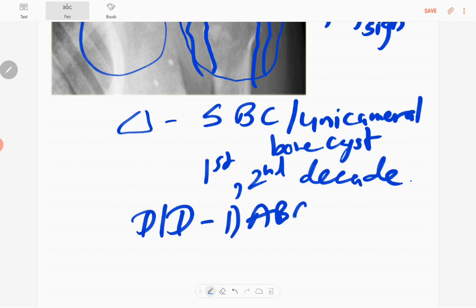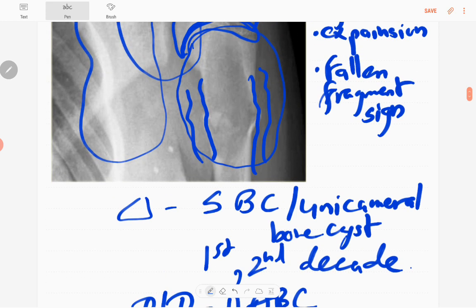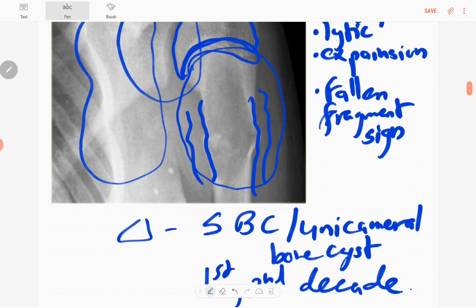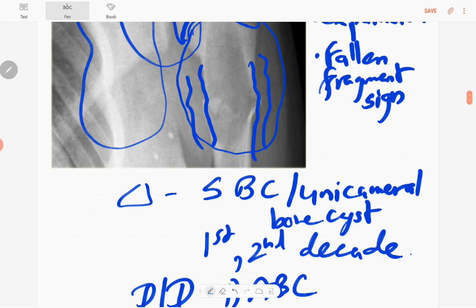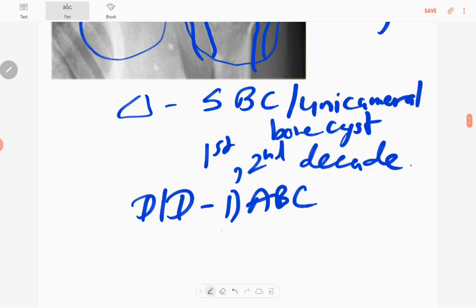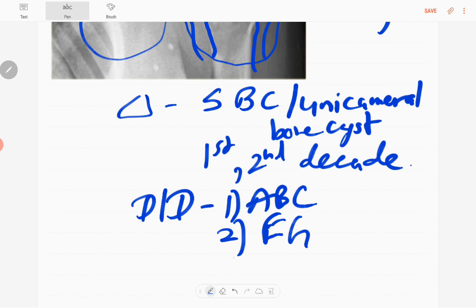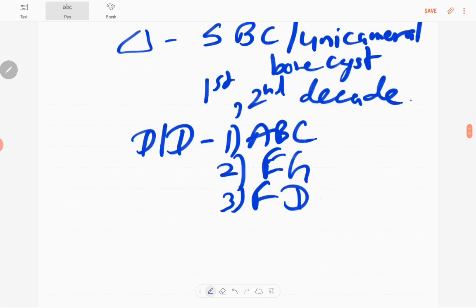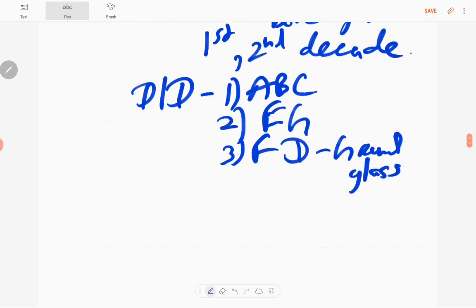The differential diagnoses include: aneurysmal bone cyst, which is usually multilocular and eccentric, originating at the metaphysis and extending to the epiphysis — whereas simple bone cyst extends to the diaphysis. Second is eosinophilic granuloma. Third is fibrous dysplasia, which in young children shows a ground-glass background appearance. Those are the three main differential diagnoses of simple bone cyst.